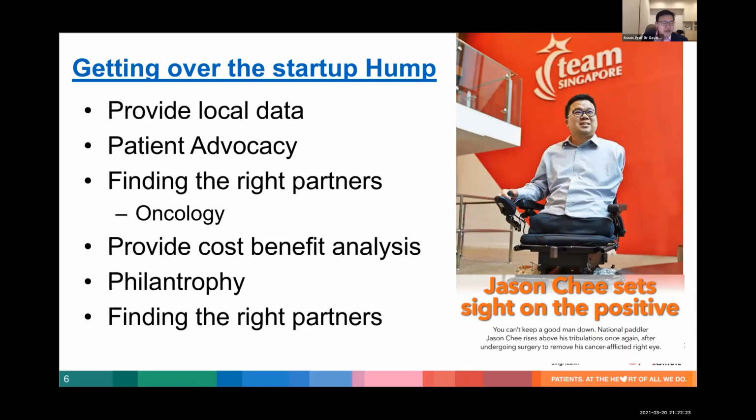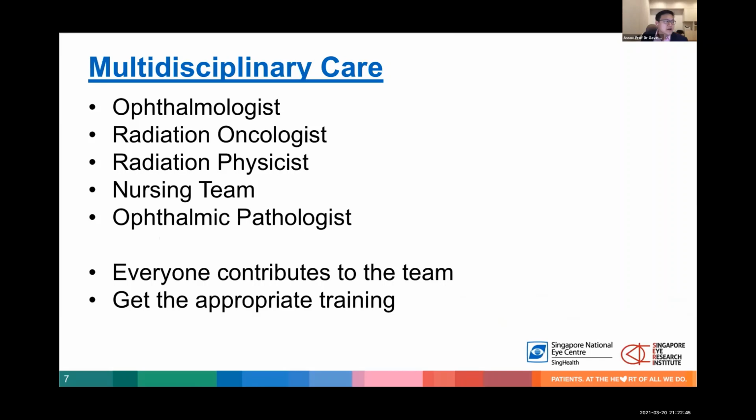I mean, people always talk about the latest modality being popular, being proton beam therapy, but that's phenomenally multiple times more expensive than setting up plaque brachytherapy. And of course, in our case, and perhaps in your cases as well, sometimes looking for philanthropy is quite important and useful. And as I mentioned in my talk earlier, it's going to be a multidisciplinary care.